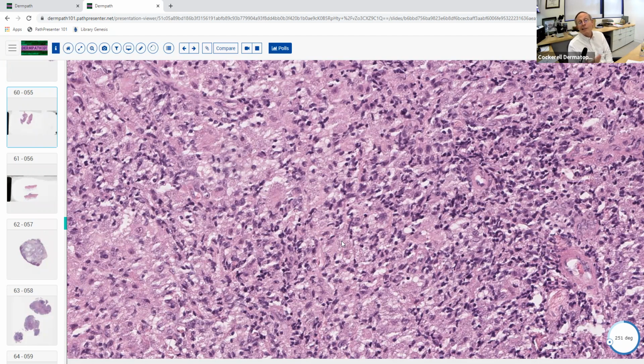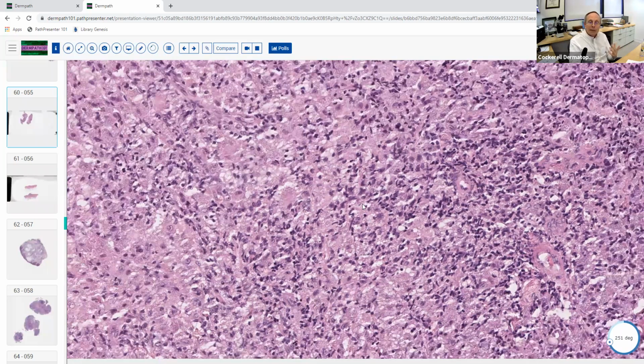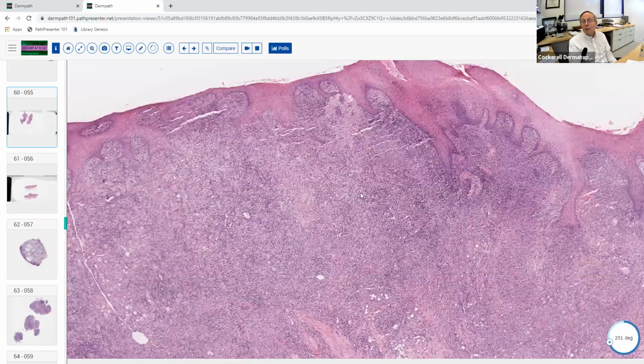So even if you didn't recognize the organisms, you look at that and say, it's not cocci, it's not leishmaniasis, et cetera. So you can work your way backwards with pathology and figure out that this has to be histoplasmosis. Nothing else really looks like that, and nothing else will really give you that pattern of the question. So this is a beautiful example of histo.